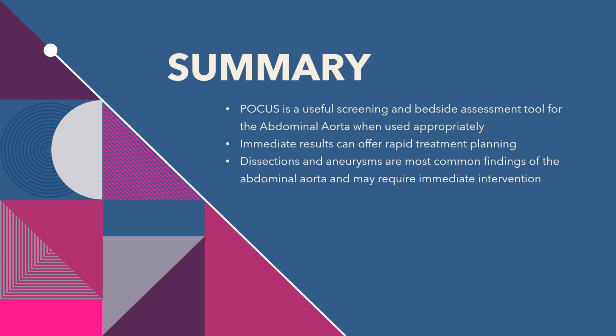It can also be very useful in bedside emergency situations where you're concerned about a rupture. Immediate results can offer rapid treatment planning, especially in cases such as those ruptures. Dissections and aneurysms are going to be the most common finding of the abdominal aorta and require immediate intervention. They can be assessed either in a radiology department or at the bedside. You can gather a lot of information to help that patient immediately.